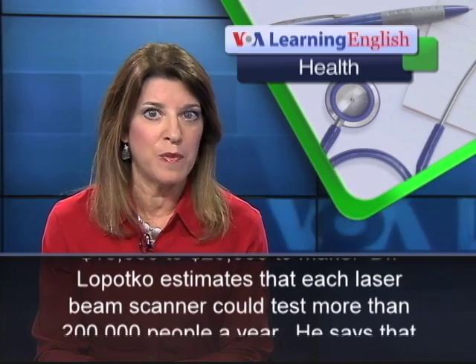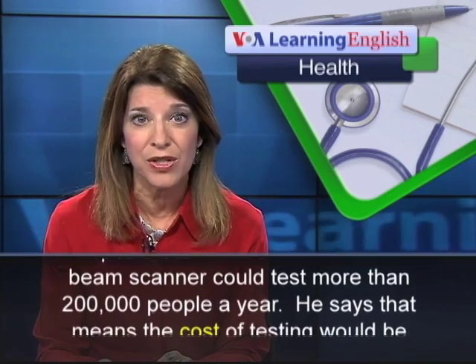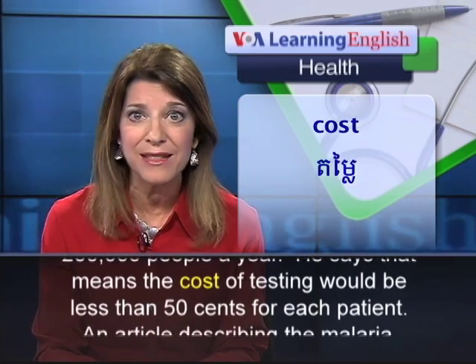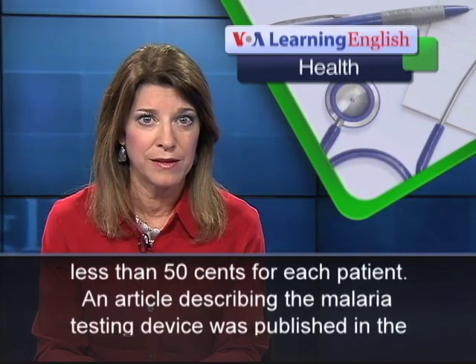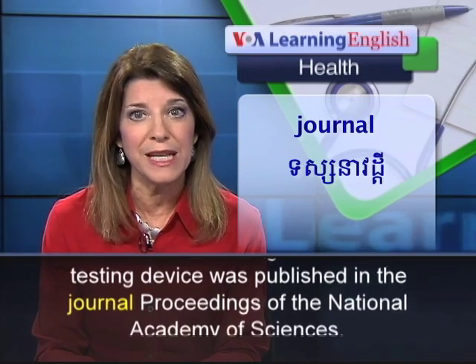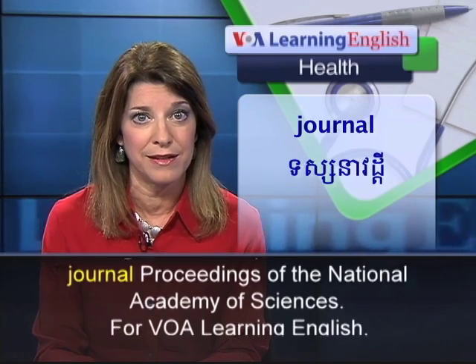Dr. Lopatko estimates that each laser beam scanner could test more than 200,000 people a year. He says that means the cost of testing would be less than $0.50 for each patient. An article describing the malaria testing device was published in the journal Proceedings of the National Academy of Sciences. For VOA Learning English, I'm Carolyn Prasuti.